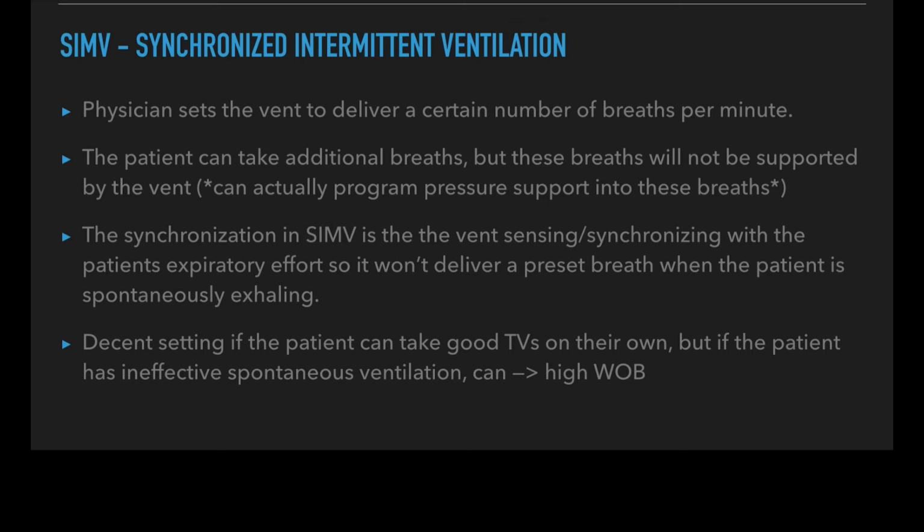It's a decent setting if the patient can take good tidal volumes on their own, but if the patient has ineffective spontaneous ventilation, it can lead to a high work of breathing. Like they're trying really hard, they're trying to breathe 30 times a minute, they're taking really small tidal volumes aside from the ones that the vent delivers them. They're working a lot, they're inefficient, it doesn't work out so well.